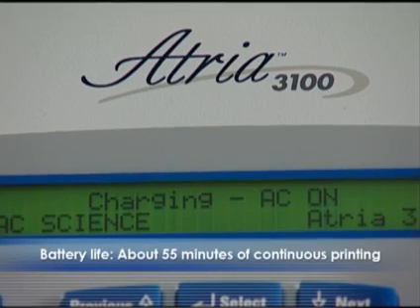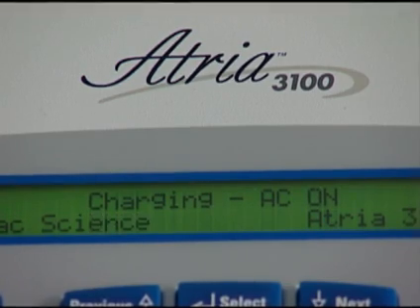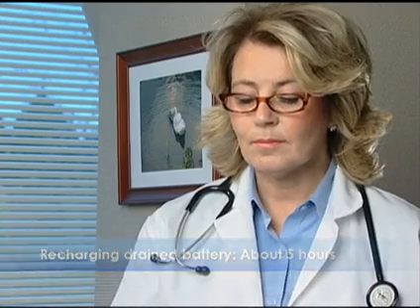A fully charged battery will last approximately 55 minutes of continuous printing in the manual rhythm mode. Total battery time varies based on use. To maximize battery life, keep the unit powered off when not in use. A fully drained battery will take 5 hours to recharge.